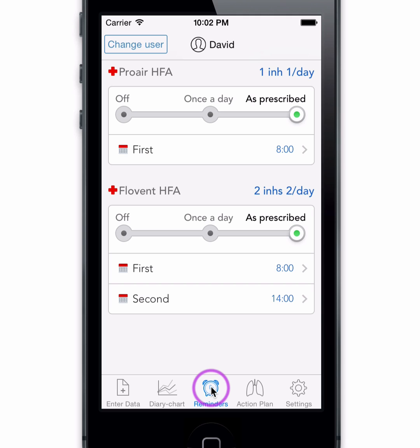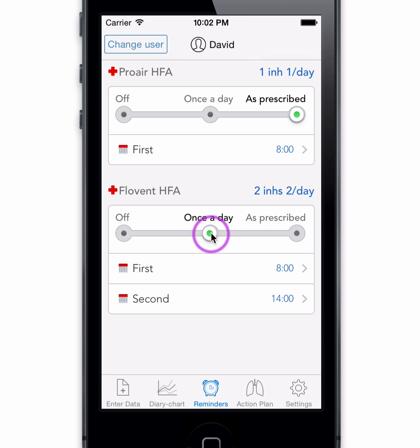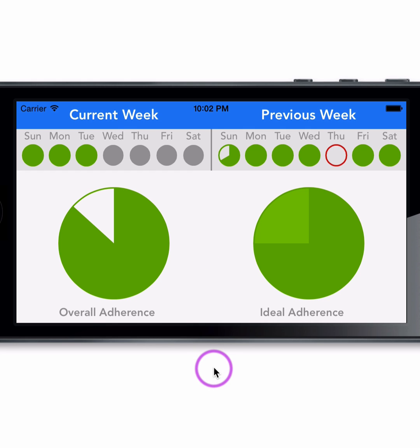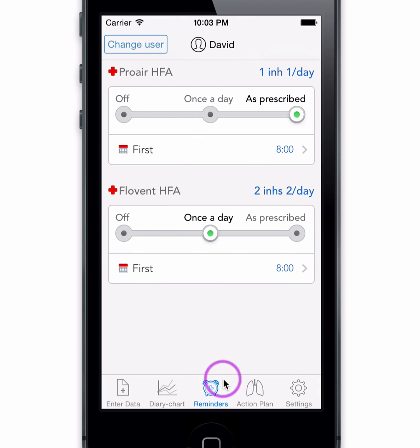Our integrated reminder system has automatically selected a reminder schedule for you. You may customize or turn off as desired. Flip the reminder screen horizontally to visualize how well you have followed your prescribed regimen and ensure you maintain an ideal adherence goal. Flip back to vertical position to navigate out.